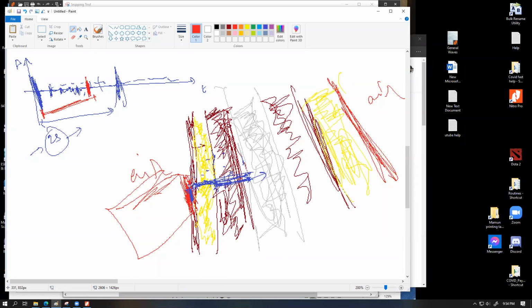So using that gel in between, let me show that gel with, let's say, purple. Placing that gel between the sensor probe and the skin takes the air out of the equation. That way we can send a very strong ultrasound pulse into the patient's body, and it becomes easier for the detector to do its job. But if we did not use the gel and directly rubbed it on the patient's body, there would be a significant reflection of the ultrasound at the boundary into the air. And as the signal would enter from air into the patient's body, a very weak signal would be entering. That's why we use the coupling medium.